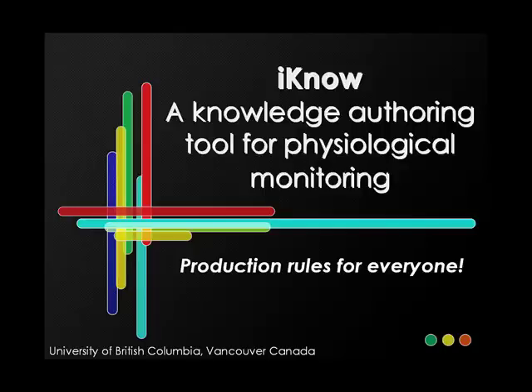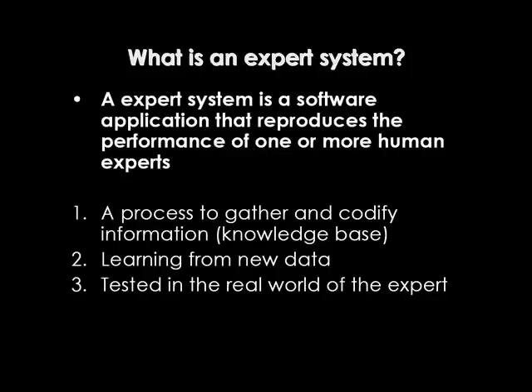iKnow is a knowledge authoring tool for physiologic monitoring that's been produced at the University of British Columbia. Before we can talk about knowledge authoring, we need to understand what is an expert system.